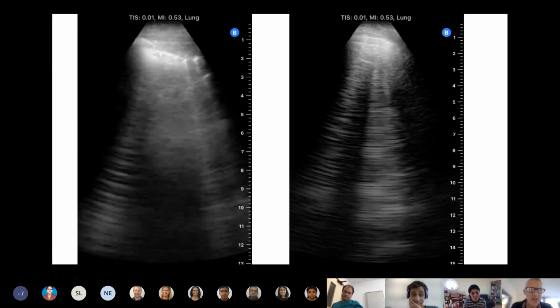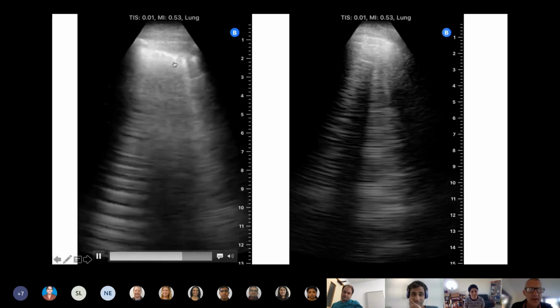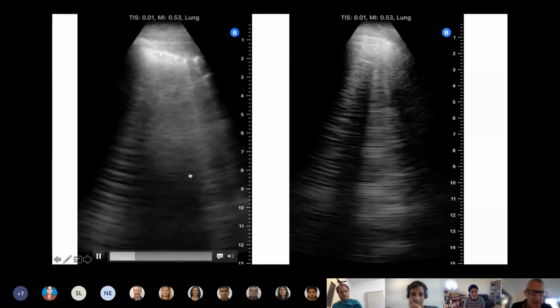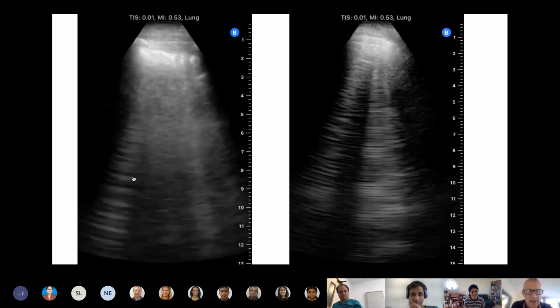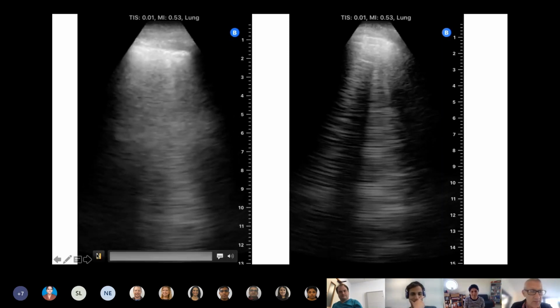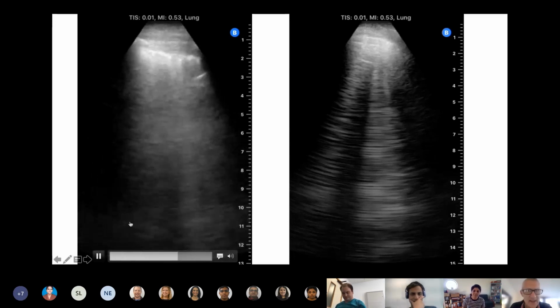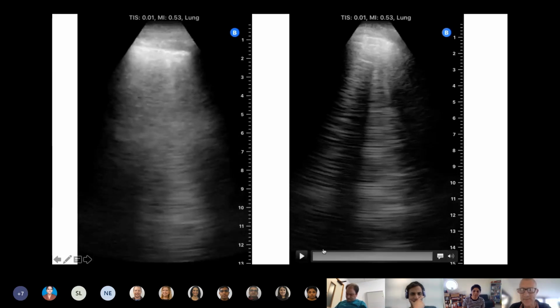So here, this was taken from the left axilla, and you see a very irregular pleural line here, suggesting there may be some subpleural darkness here, but these B lines, as you'll see, are these lines coming from the pleura all the way down the length of the field, and those are B lines, and that's an interstitial syndrome. There's fluid in the lung interstitium, and combined with this very irregular looking pleura, this is what we really recognise to be due to COVID itself, with a nice subpleural dip there. We've got lung sliding, so we definitely know there's no pneumothorax because we've got all these B lines in activity here. So you're looking at a lung that's adherent to the pleura, and there's signs of COVID change within it.